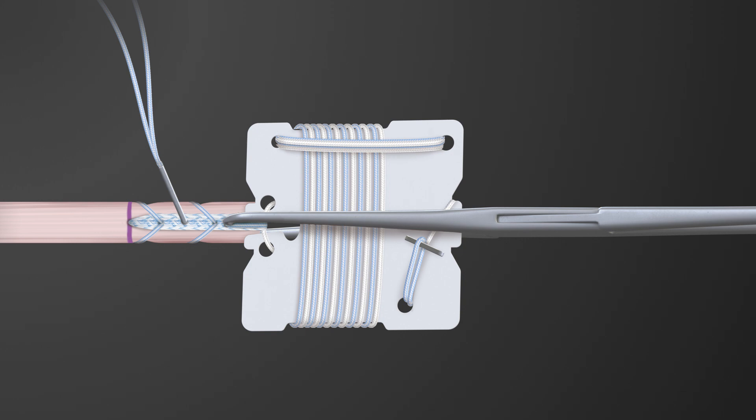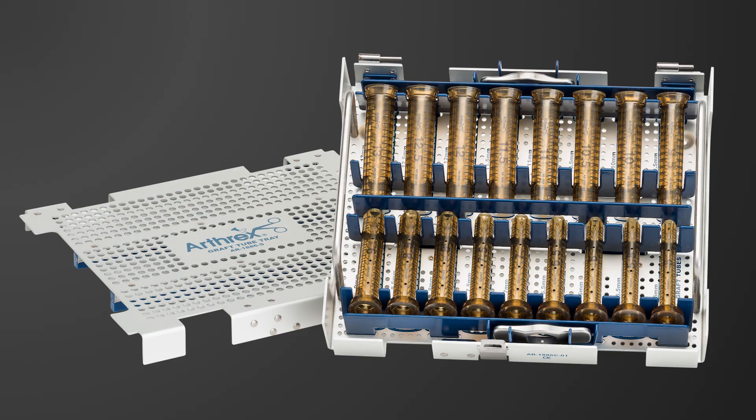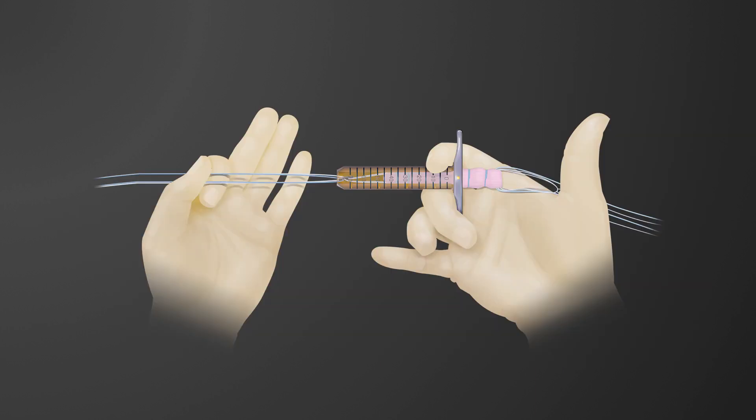An internal brace was then incorporated into the femoral end of the graft. We then took the graft compression tubes to take our construct, which was now 10.5 millimeters, and compress it down to a graft of 9.5 millimeters.